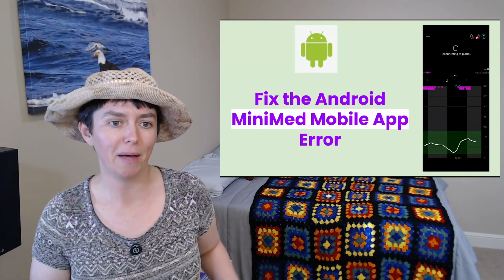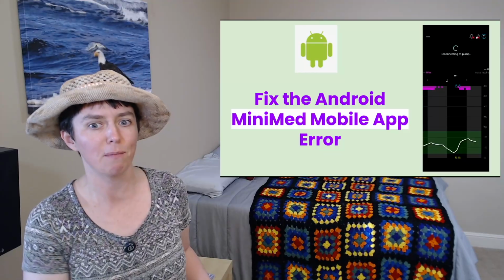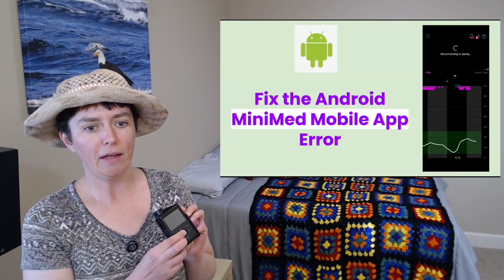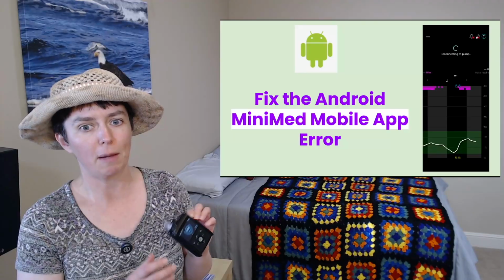Hello, welcome. I imagine you're watching this video because you're having a frustrating problem with your Android MiniMed mobile app. This is the official app from Medtronic to view your blood sugar on your phone. And if you use a Medtronic MiniMed insulin pump, you're probably using this app.